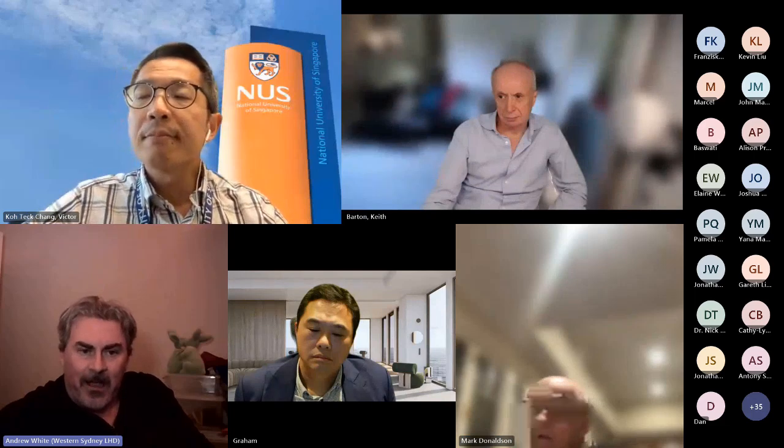And the last one I put in, that is what happened. But I favoured doing a Paul tube, and I favoured a tie, because the guy still had silicone oil in the eye that the retinal surgeons did not want to take out. And I did not want a large bore tube, which was just going to suck everything up from behind the IOL, which was sitting nicely. So I was trying very hard not to poke a bear with a stick and still give him a reasonable pressure.